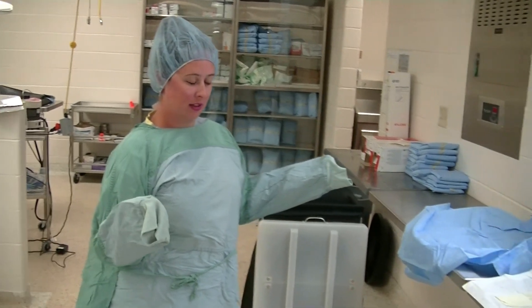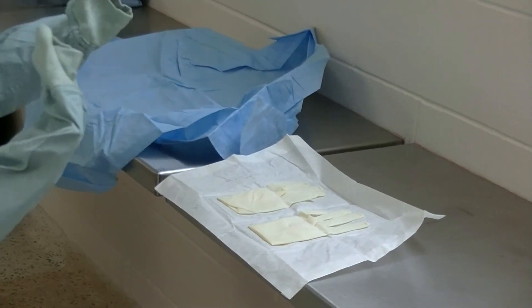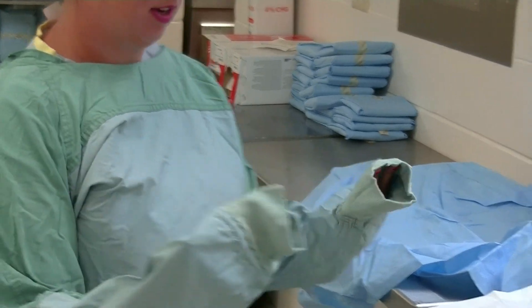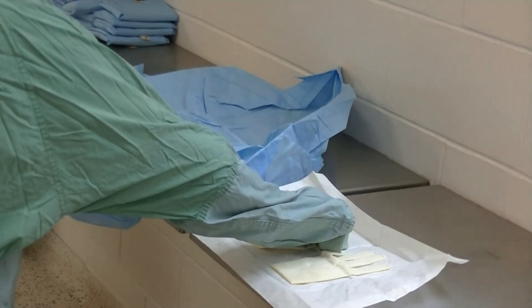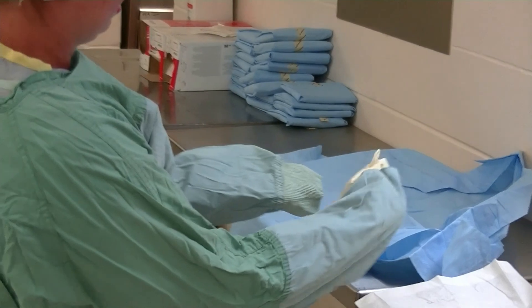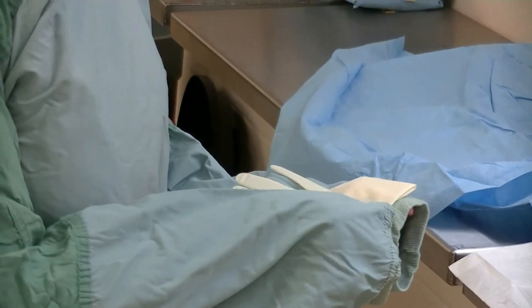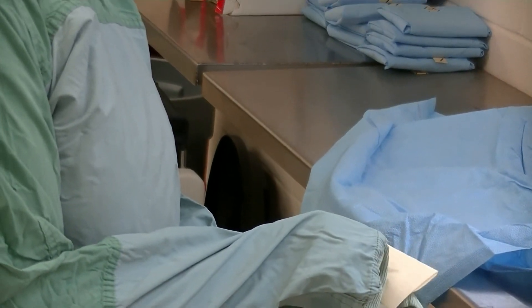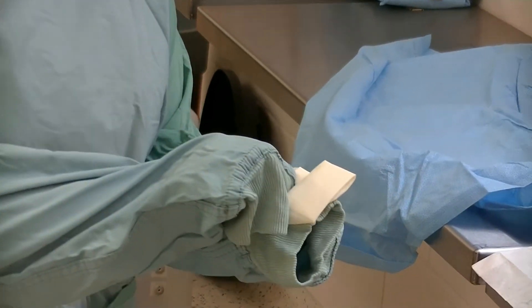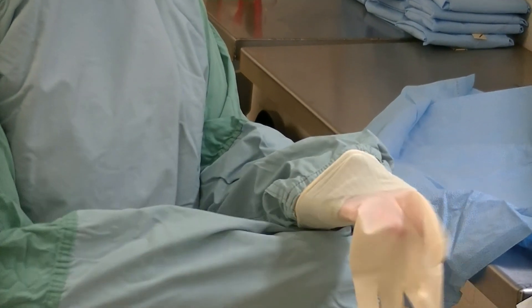Next we're putting on our gloves before doing the final tie of our gown. Make sure your fingertips are fully hidden inside your gown the entire time. I'm going to do my non-dominant hand first — I'm right-handed so I'll reach out with my right hand, grab my left glove, take the thumb side and place it flat down on the cuff of my gown. With your hand still inside your gown, your left hand grabs the inside edge of the glove and pulls it over your entire gown.